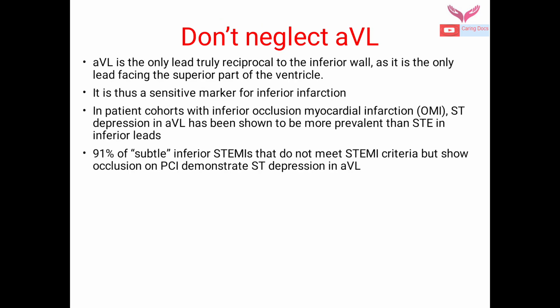We should never neglect the lead aVL. aVL is the only lead truly reciprocal to the inferior wall, as it is the only lead facing the superior part of the ventricle. It is thus a sensitive marker for inferior infarction.